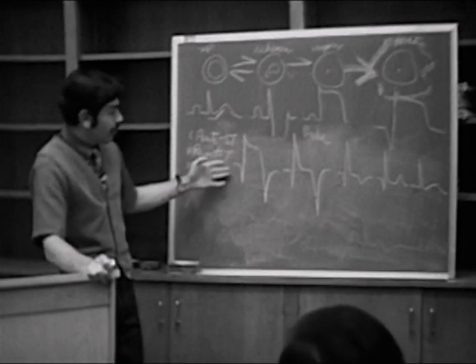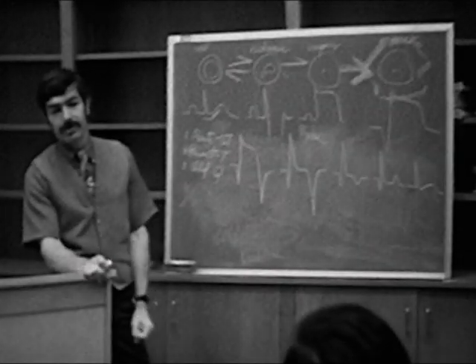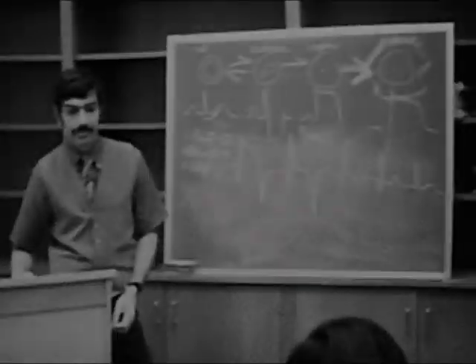So that's the potential importance of recognizing the age of the infarct. All right, then after your recent period, then you develop these Q waves, and these, as I said, these Q waves may persist for years. In some cases, they disappear.